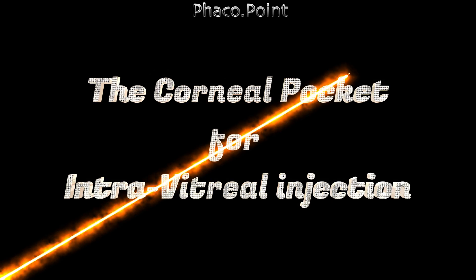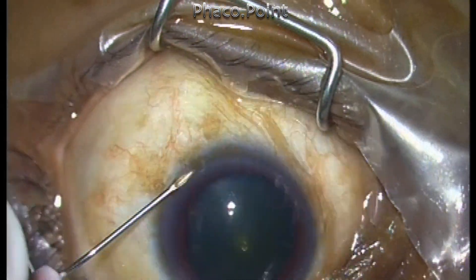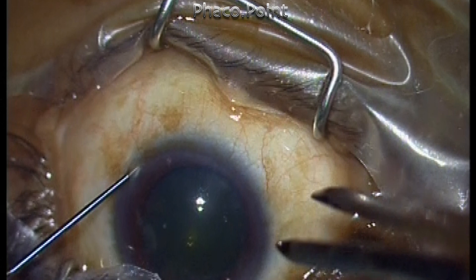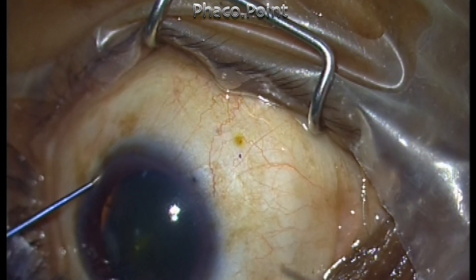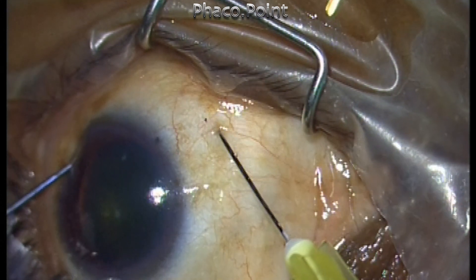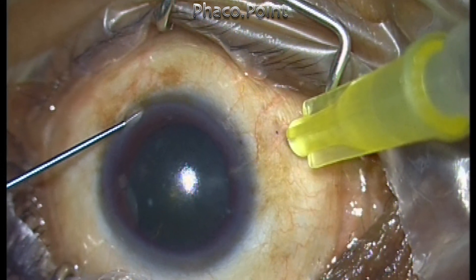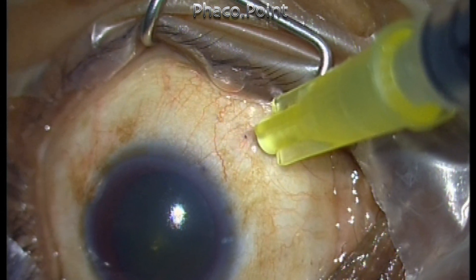There are several advantages and uses for the pocket incision — I initially created it for LRI purposes, but I have since given up performing limbal relaxing incisions. This is a patient in whom intravitreal Avastin is being injected. We measure four millimeters from the limbus as the eye is phakic, mark that area, and use the corneal pocket incision to get good fixation. This is done under topical anesthesia using a 30 gauge needle. Using a tooth forceps can sometimes cause conjunctival tear and subconjunctival hemorrhages, whereas the pocket incision through the clear cornea does not induce any astigmatism, and even if you inadvertently enter the eye it still does not matter because this is a tunnel incision.